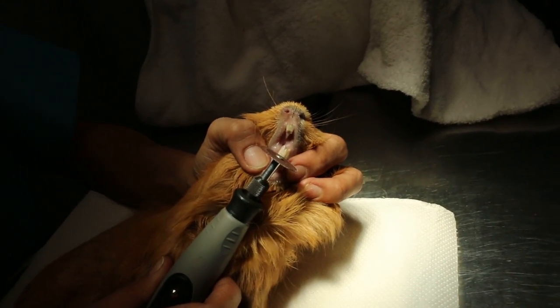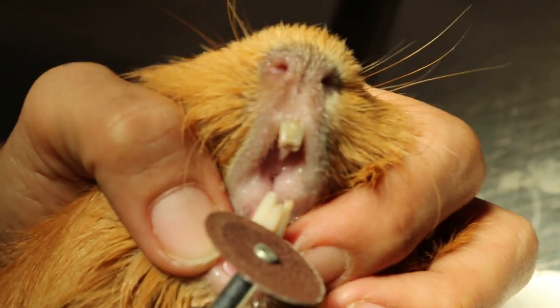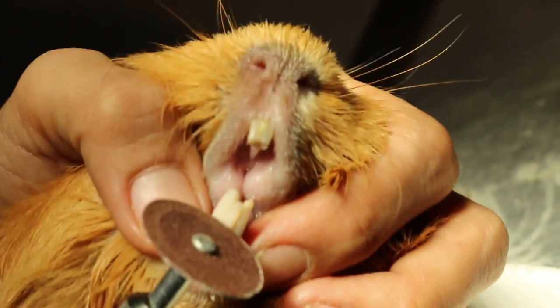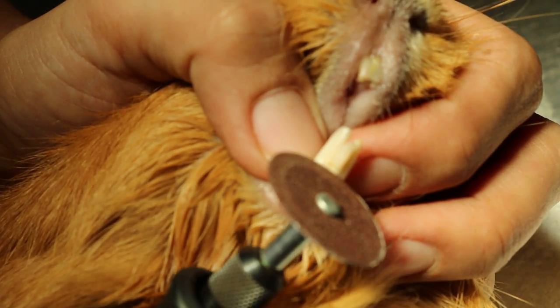We are using the burr to trim the teeth. You can see the upper one has been burred. The lower one, you can see that this is about a bit trimmed.